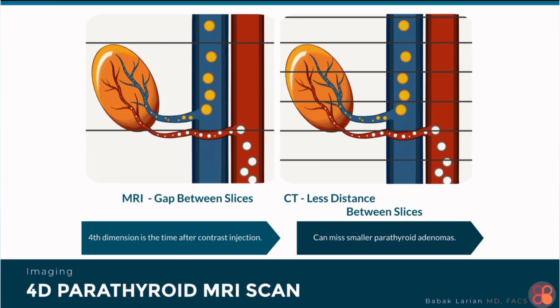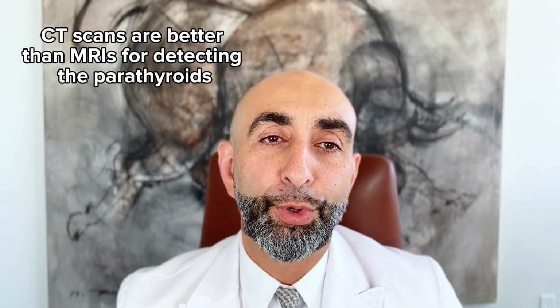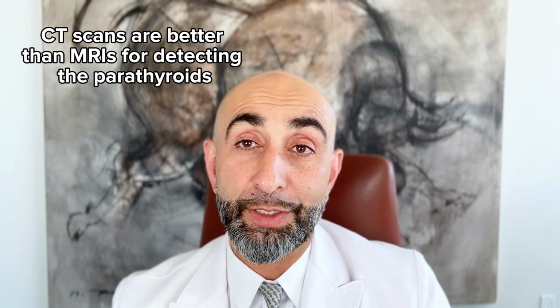There is such a thing as a 4D parathyroid MRI. We don't use it as often. We really use it only in people who are really allergic to the contrast material for a CT scan. They have iodine or shellfish allergies and get anaphylactic and swell up and can't breathe, right? If the allergy is milder, we can give them steroids and do the 4D CT scan.